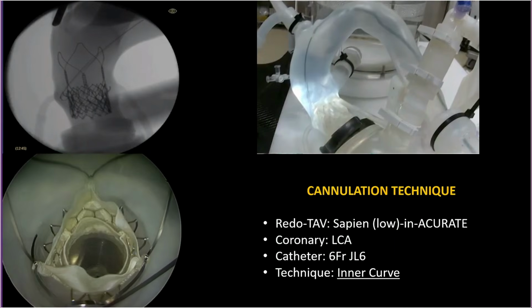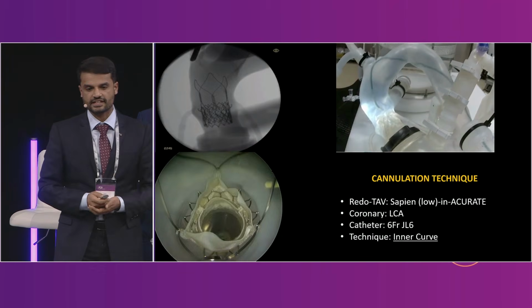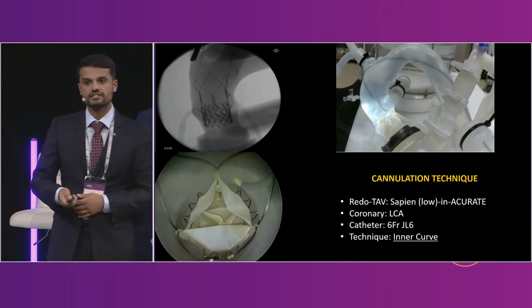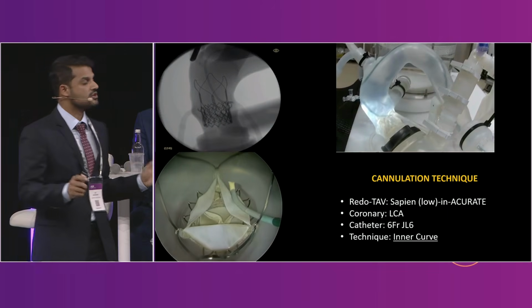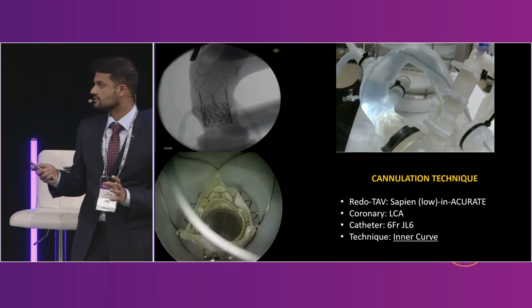So this is a final example of a very challenging situation. Redo TAVI, and once again, same concept. Oversized Judkins left 6. Coming down and entering. And exactly like Ollie's question, like many of you might be asking, I've never used a JL6. In fact, show of hands, who's ever used a JL6 catheter in the cath lab? Next question will really be, who actually has a JL6 catheter in the cath lab? I can tell you that I even wouldn't know where to find one in my own cath lab. But the question is why?